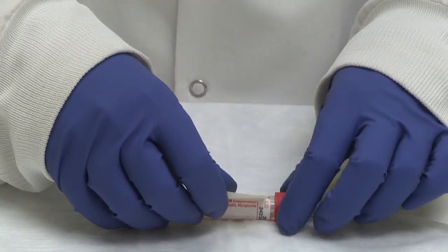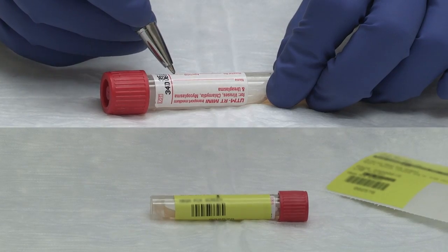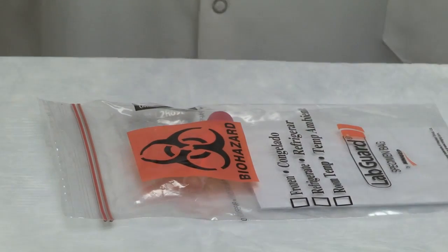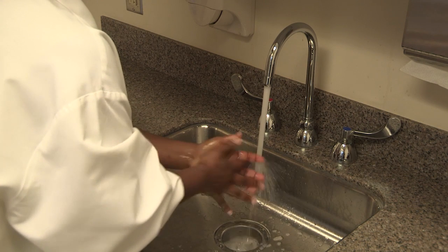Apply patient identification label or write patient information on the tube label. Follow the standard operating procedures of transport and testing in your facility. Remove gloves and perform hand hygiene.